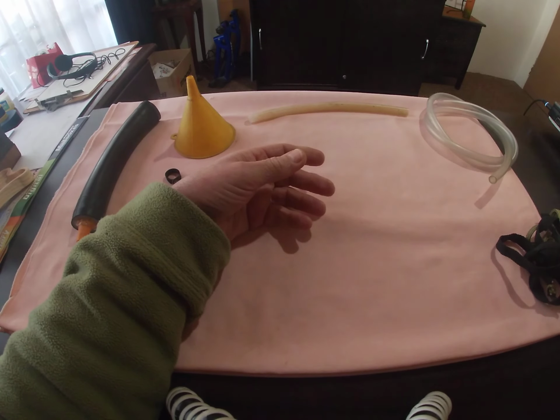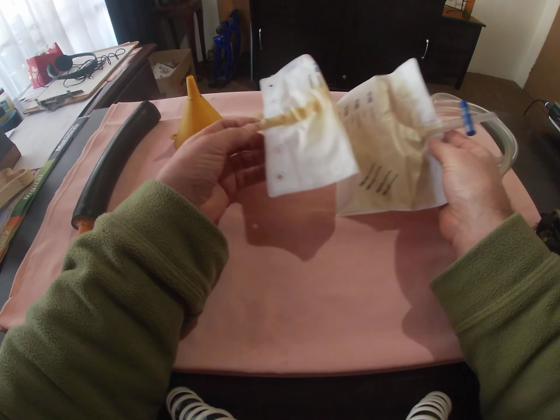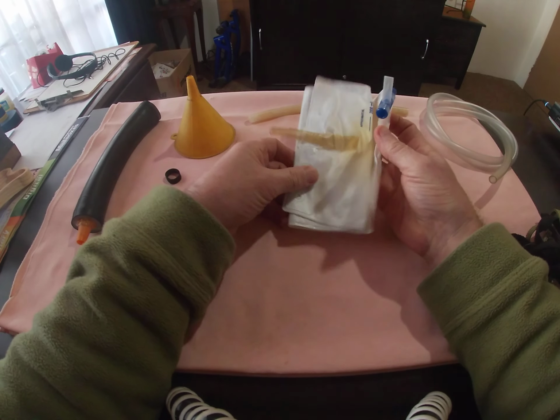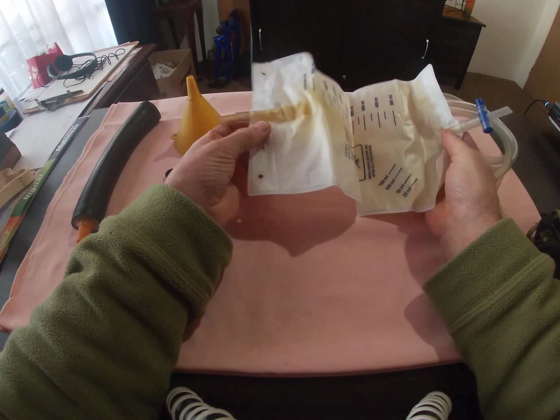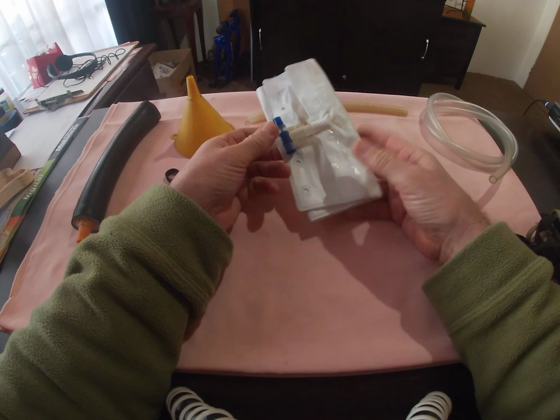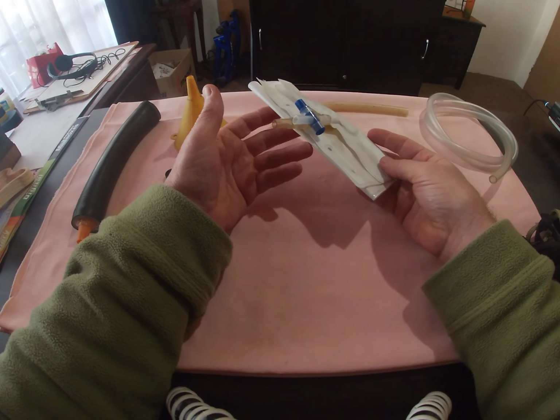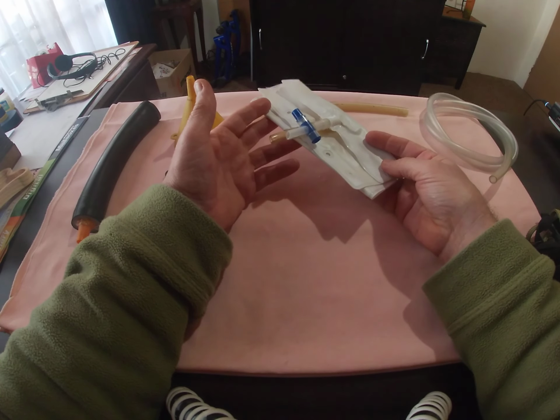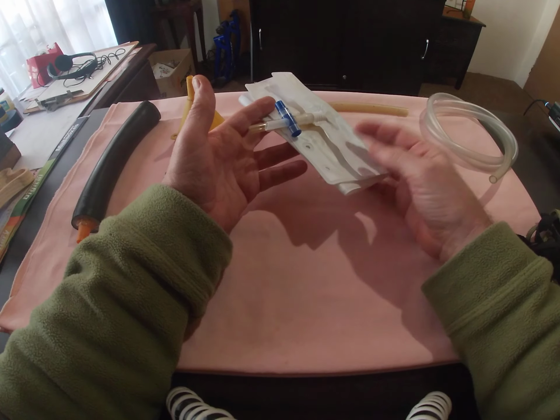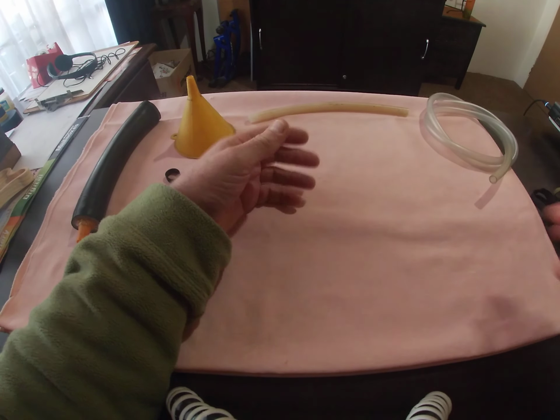And at the end, if you're going to do this, you're probably going to go for a prostate operation, and you will come back home with a carry bag like this. If you don't have one of these, then you can buy them from the hospital. You will definitely come into contact with one or two of these things if you're going for the operation. Okay, so how did I do it?